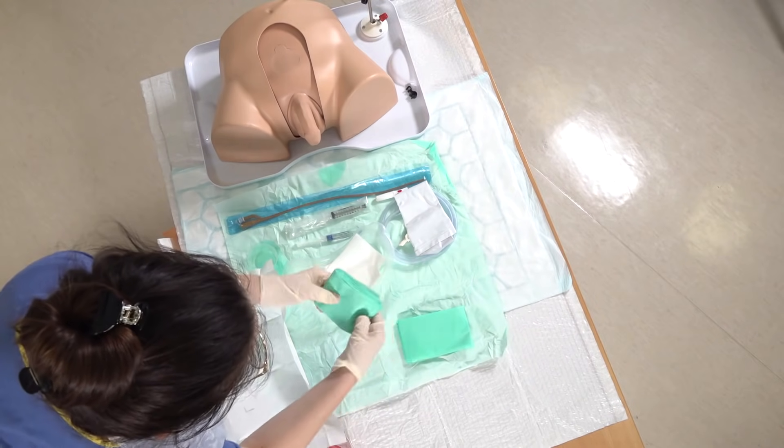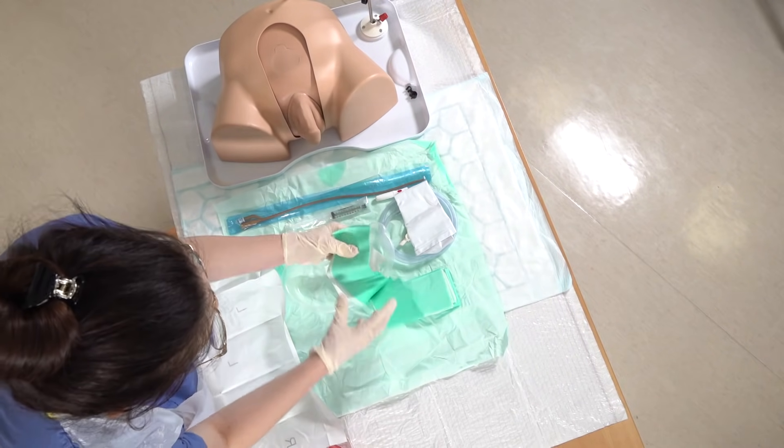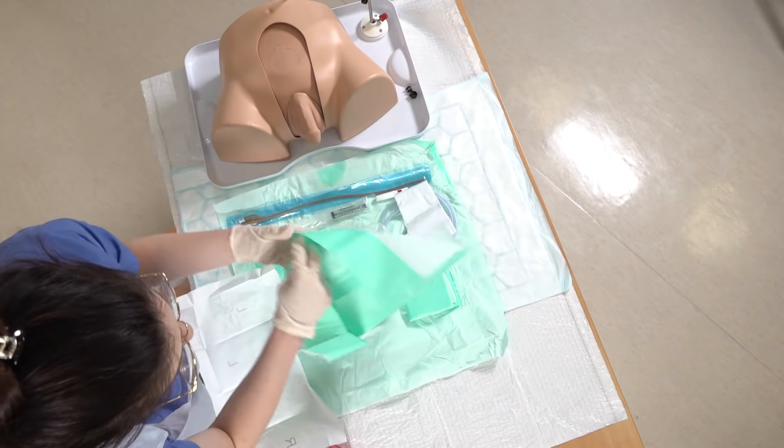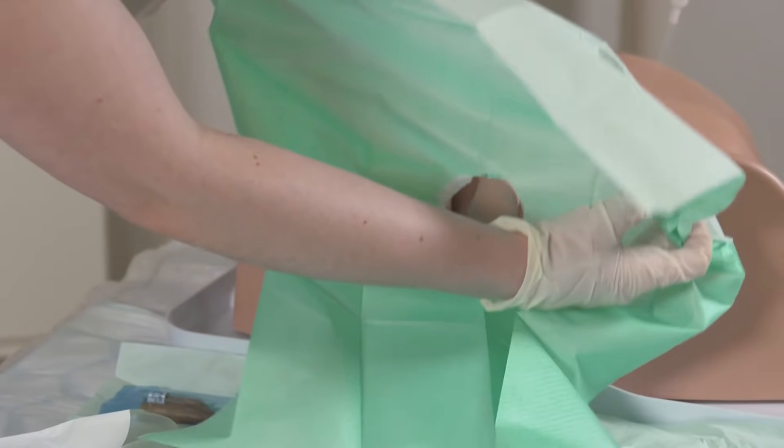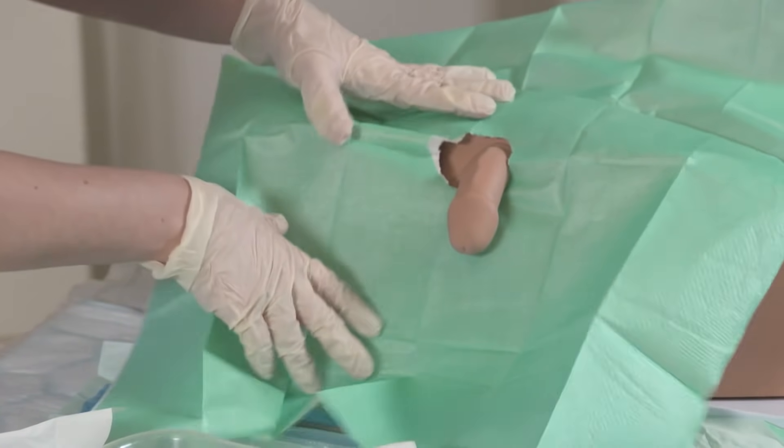Then we have a drape which I've already torn a circular hole in before we started — but you do that at this point now. Place this with the penis through the hole.